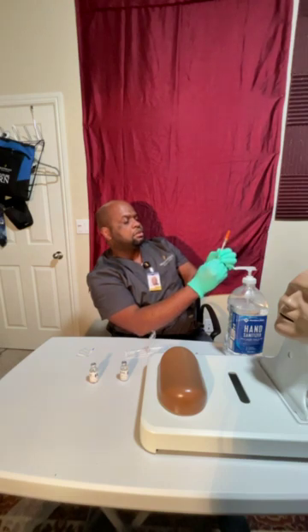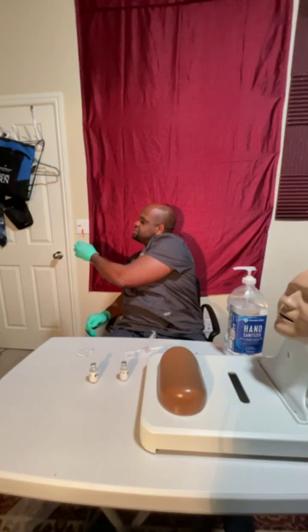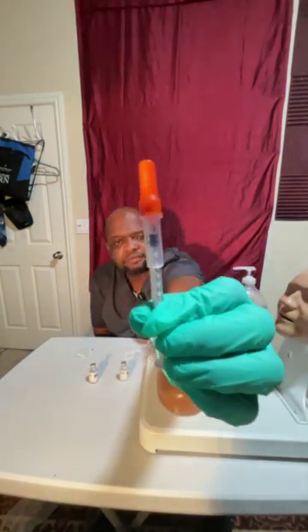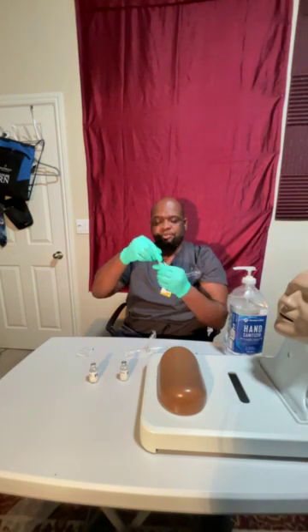Good. 8 units. Okay, I have Agnes here to verify that 8 units right there. I'm going to bring this closer to you guys to see the 8 units. There's the 5, and you want to count the 3 there, right?